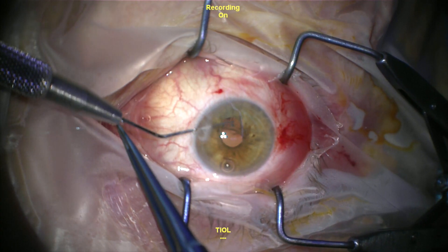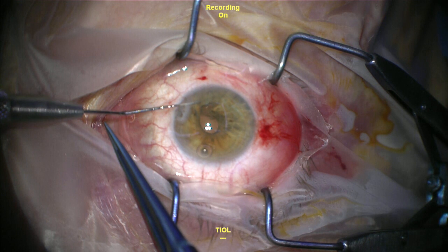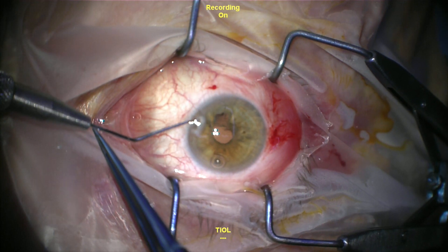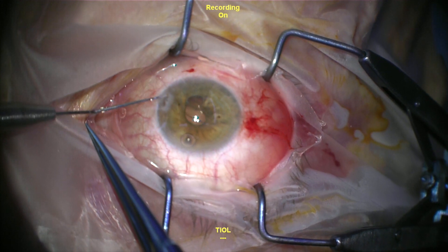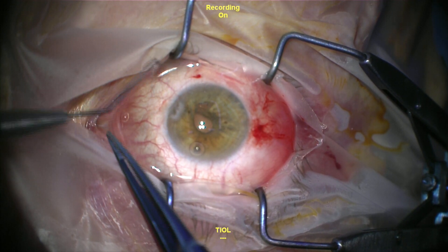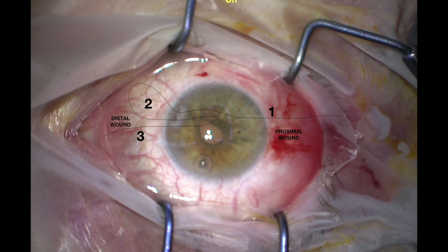Once you start with your initial suture that's passed through the iris, insert the Cougan hook into the anterior chamber and take a loop of the suture that is proximal to where the suture passes through the iris defect, and pull it out of the distal wound. It's important that the loop you create is large enough to be easily worked with — you can always make it smaller by pulling on the proximal end. We now have a configuration with part one being the proximal end, part two being the proximal end pulled through the distal wound, and part three being the distal part that has already passed through the iris defect to be repaired.